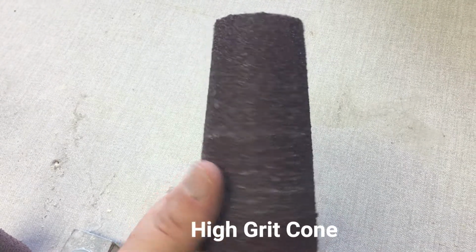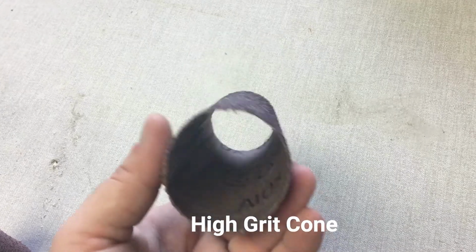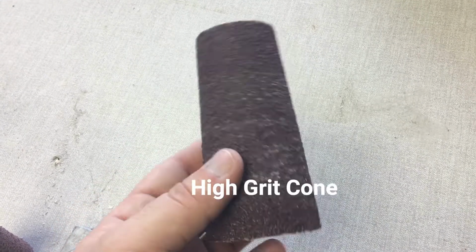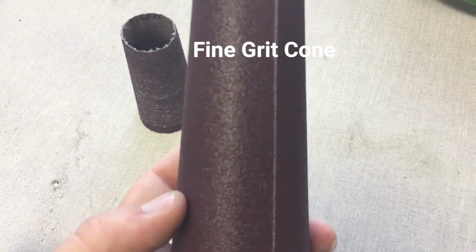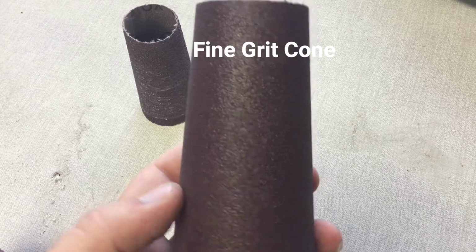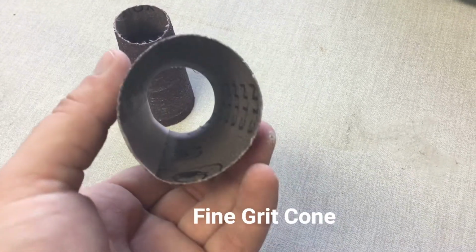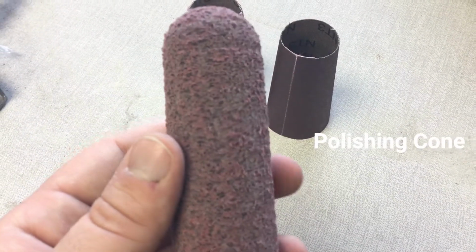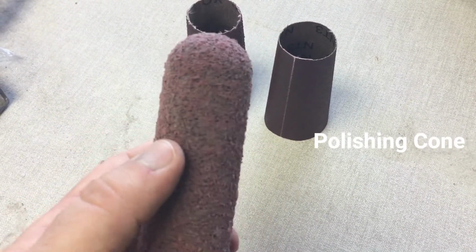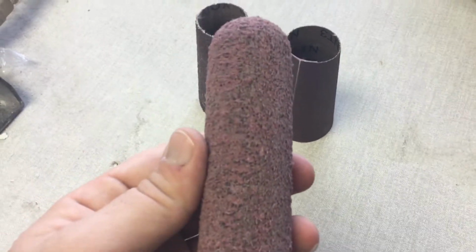The types of cones we'll be using are, first, a high grit cone. Next, a finer grit cone. And lastly, a polishing cone. There are other cones that can be used, but for this video, we will be solely using these ones.